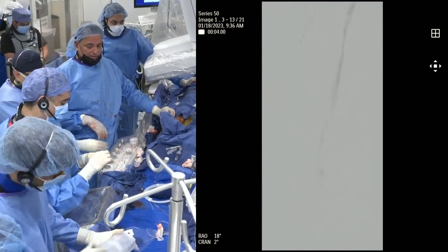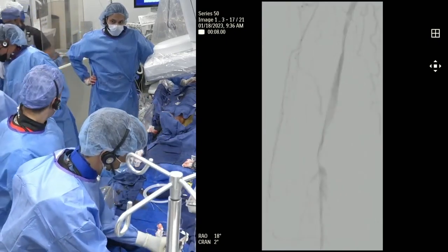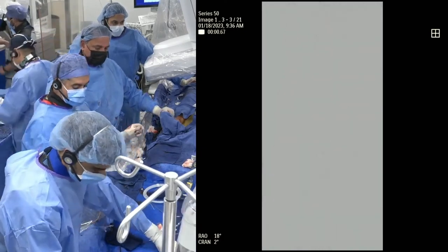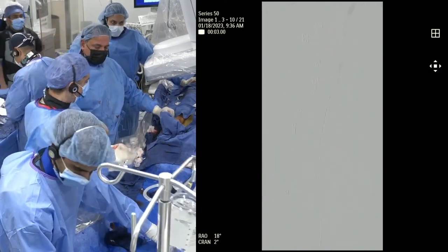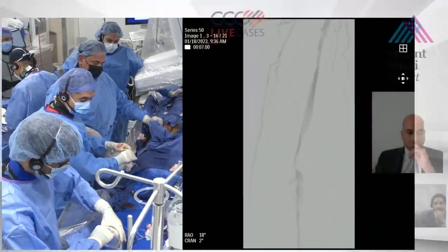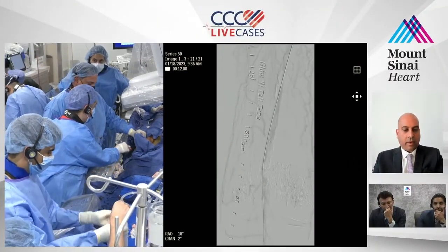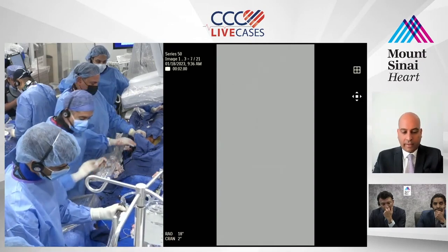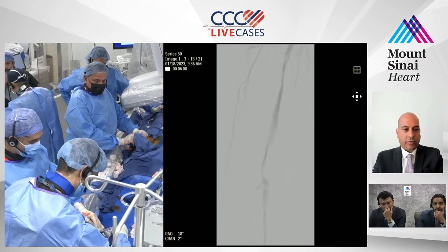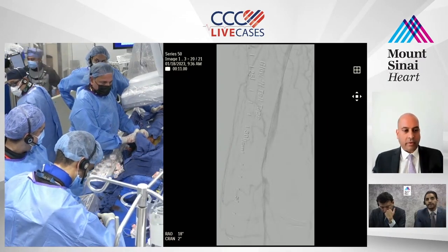Srini and Ajit, does DCB provide any added value in the common femoral? I think so. There's definitely some data that supports it. So I would think shockwave and a DCB would be a good option if it expands well. Srini, any thoughts? Yeah, I would definitely shockwave and DCB and try not to scaffold it if you can. I know there's an RCT taking place now with a DCB, but ideally, if we can try not to stent that area across the joint, it would be ideal.